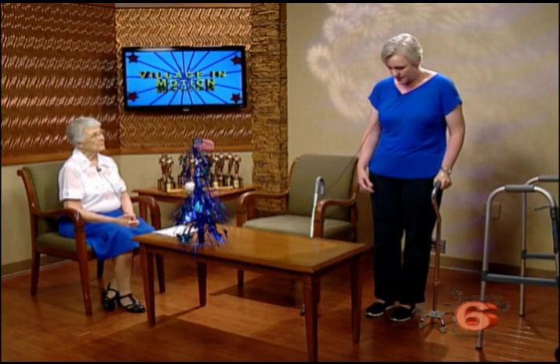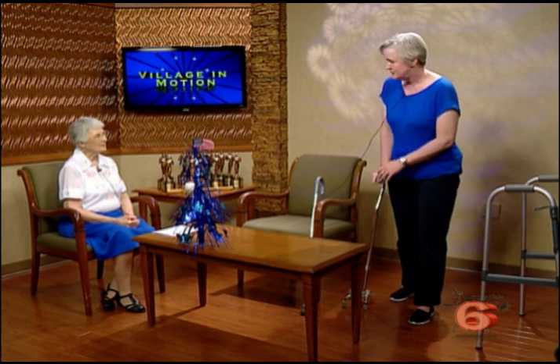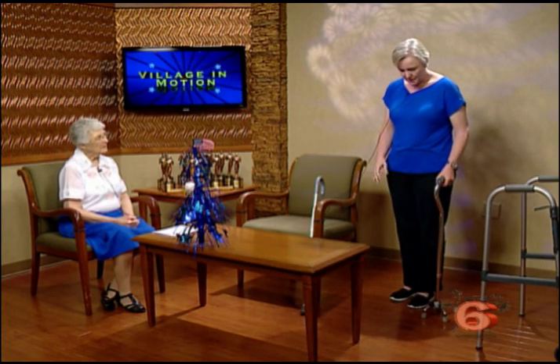Let's say you had your hip replaced. So I would take the cane and then step with that sore side, and as I'm stepping with it, I'm putting the weight and pressure through the cane. Whereas if it's over here, it's not as safe. It's not giving you the stability. So if possible, there are some circumstances where people are just so used to having it a certain way and in a certain hand that it just works better for them that way. Then we just kind of let it be. We just give our best recommendations and our best advice for safety.